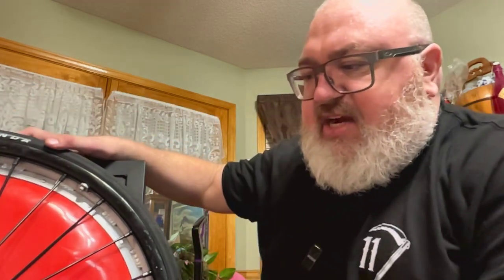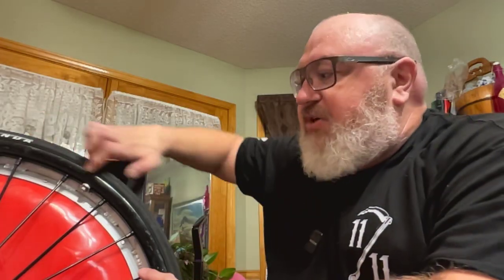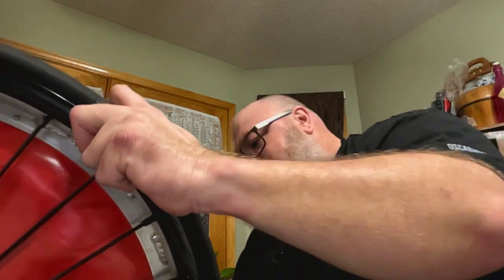So right there is 90 psi. What I'm going to quickly do is check and make sure that the tube itself and the tire, mainly the tube's not coming out of the tire. Make sure everything's seated, looks everything equal. I'm going to do it on both sides. Everything looks great. That means I did it fairly decent. I'm impressed that I knocked it out so quick.